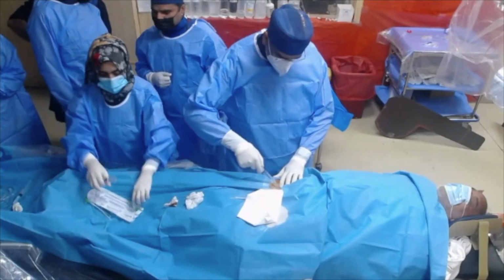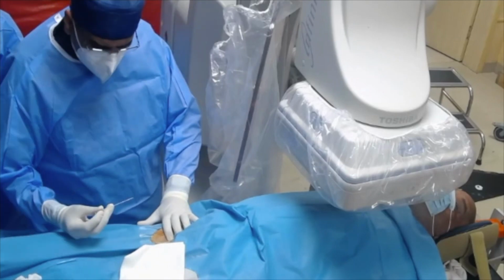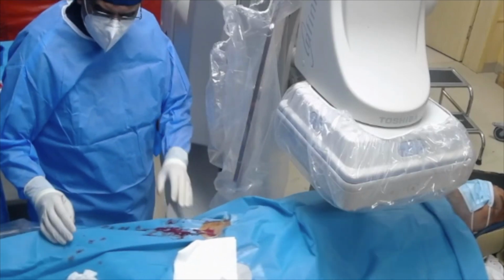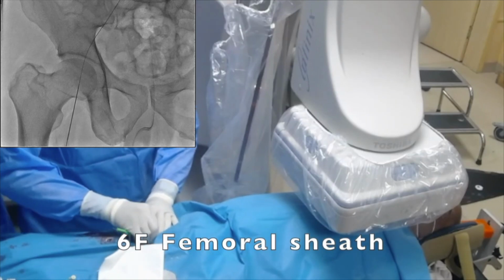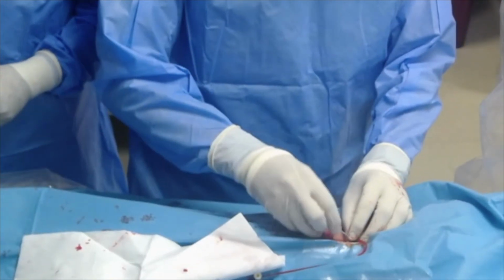Local anesthesia given in the right groin and femoral puncture done under fluoroscopic guidance. Anesthesia team called for conscious sedation. 6 French femoral sheath inserted. We perform most of our carotid diagnostics with SIM2 catheter. So 5 French SIM2 diagnostic taken and diagnostic imaging done.